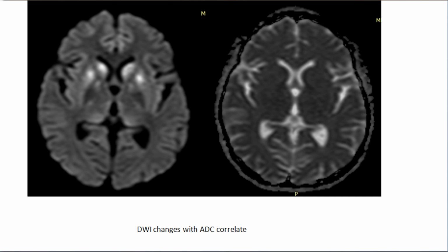Right. So what do you think is going on? What would be the first thing in your mind if you see this image? What would be the first thing in your mind? Sorry? Okay. Bilateral basal ganglia. Okay. What else? Any big guesses?